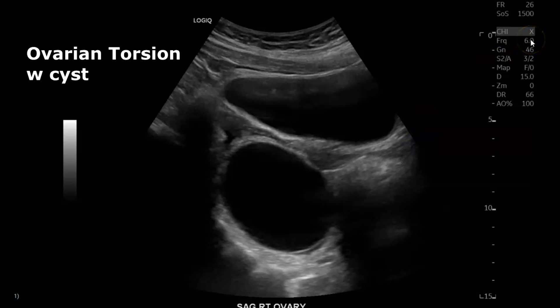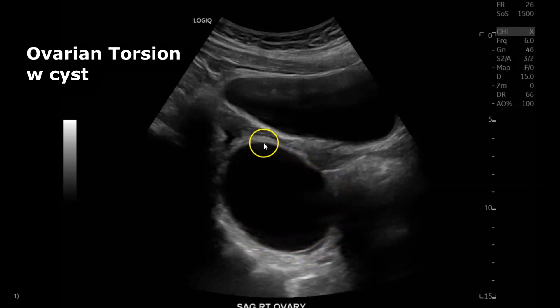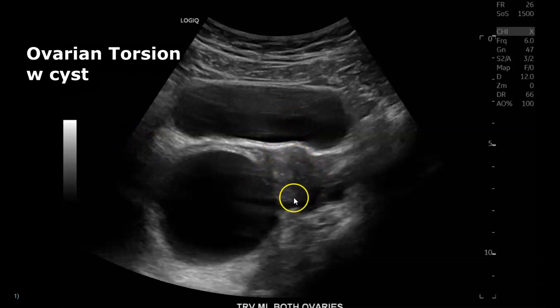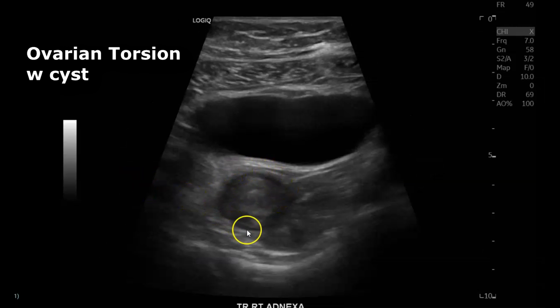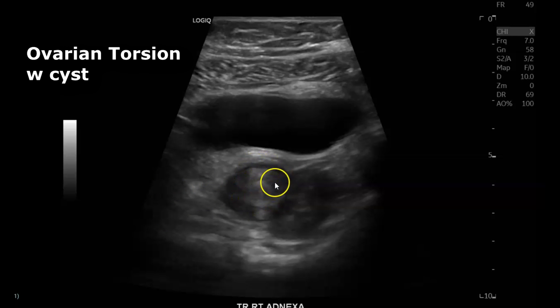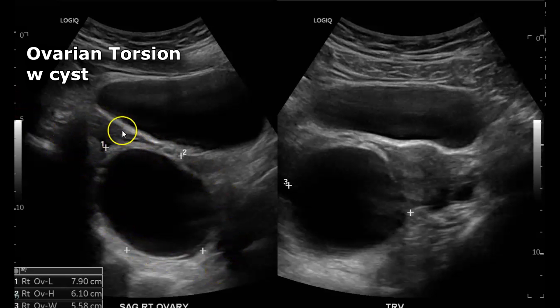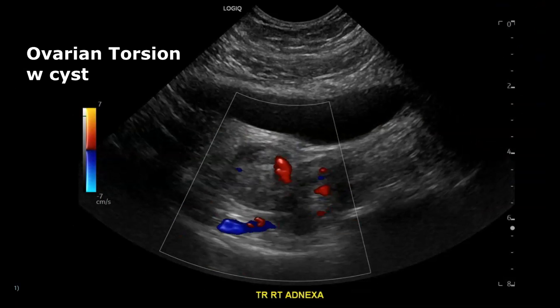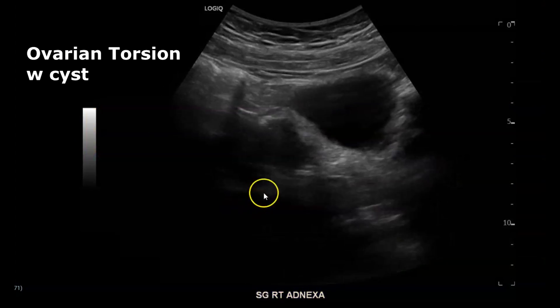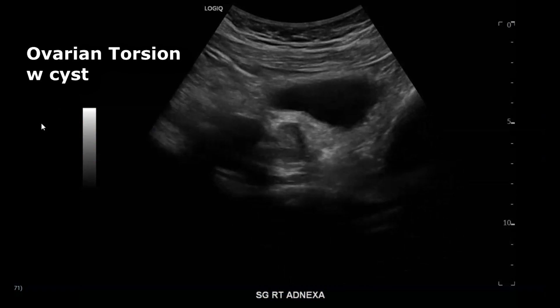Here's a pelvic scan using the curvilinear transducer. Here's the bladder, and we're in the right adnexa. There's a large cystic structure in the right adnexa from the right ovary, and no ovarian tissue can be seen. In transverse view, you can see the uterus, bladder, a small left ovary, and a large right ovary with cyst. There's a circular structure showing a bullseye or target-like lesion. With color Doppler, you'll see circumferential flow — the whirlpool sign. Given the large cyst size, the volvulus seen in this area, and the whirlpool sign, this is a case of ovarian torsion. You can see the spinning or twirling, which is the volvulus of the adnexa.